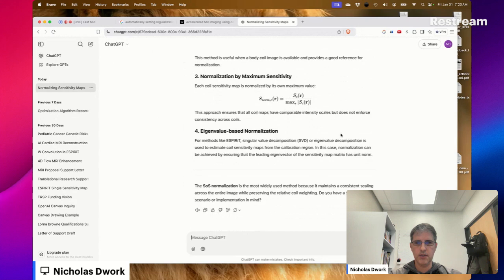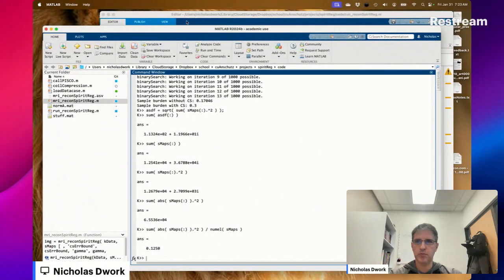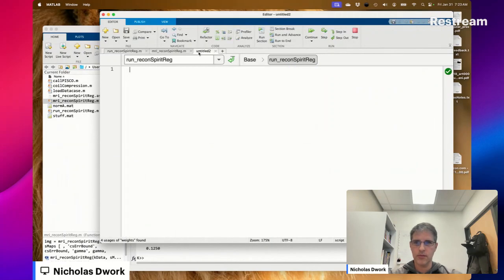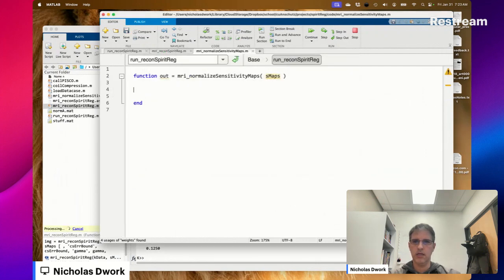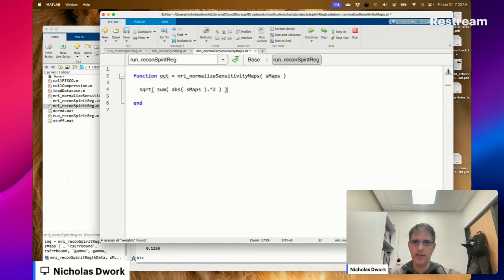Here's another one that's reasonable, so that the maximum magnitude of the sensitivity is 1. I like this one better. Normalized sensitivity maps: square root of the sum of the magnitude squared.